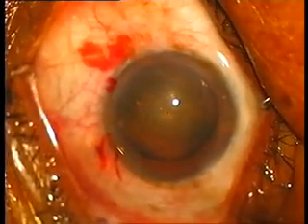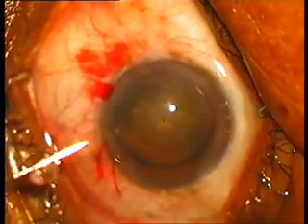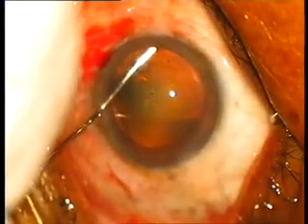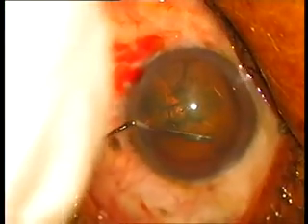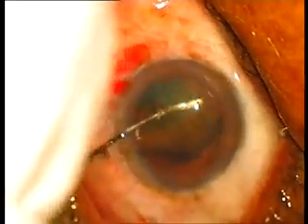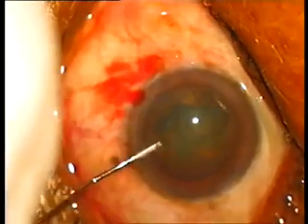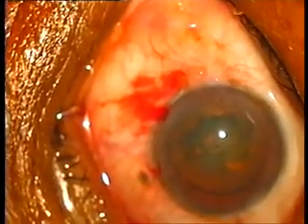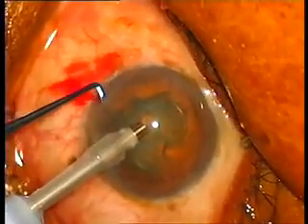Then a side port incision is made using a 15-degree knife. Then the hydrodissection cannula is inserted. I remove a little bit of viscoelastic, and then you can see the fluid wave going behind, separating the cortex from the capsule. And I'm pushing the nucleus, or just rotating the nucleus, in order to sever all the small adhesions between the cortex and the capsule. Then we start with the Phaco.